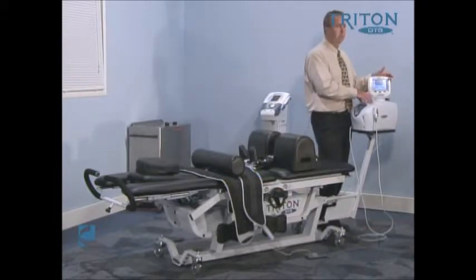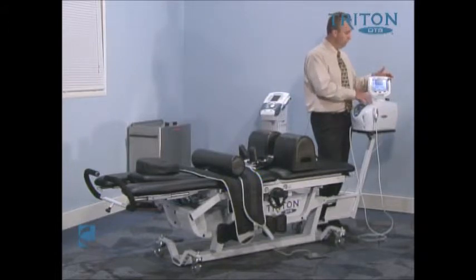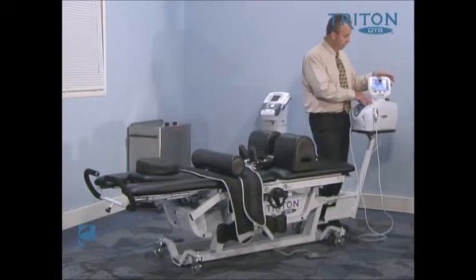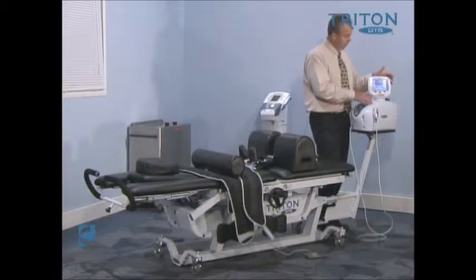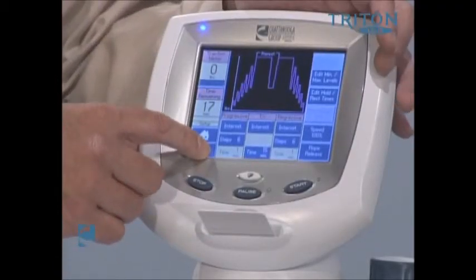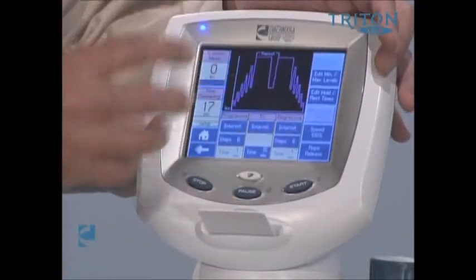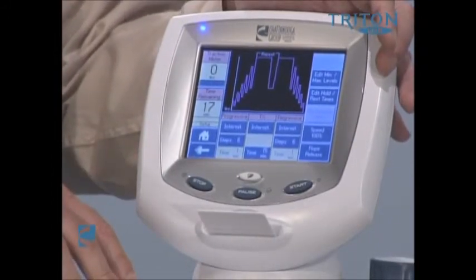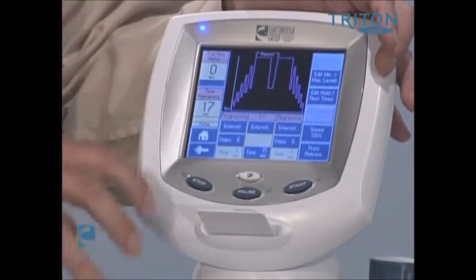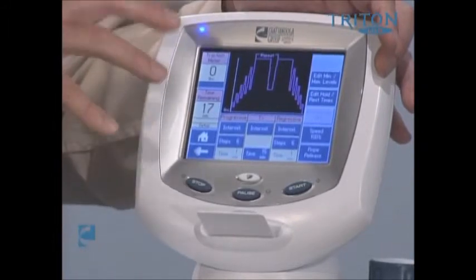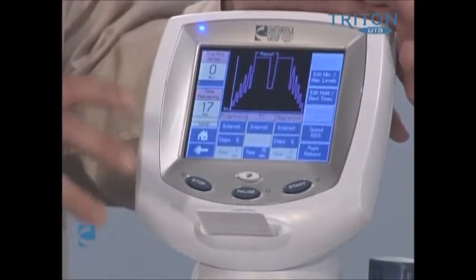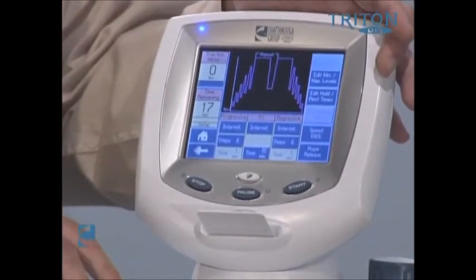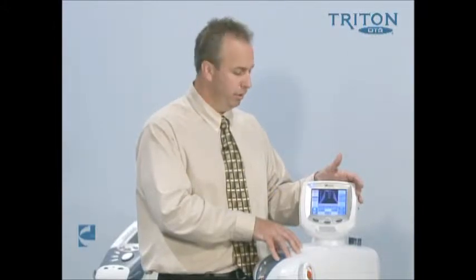Slower speeds can be more comfortable and more accommodating to people in the acute phases of a particular injury. Even during traction, we'll have an opportunity to change some of these parameters. Anything that is still highlighted in blue, we can go back in and change some of the parameters during an actual treatment if that's something we would like to accomplish.